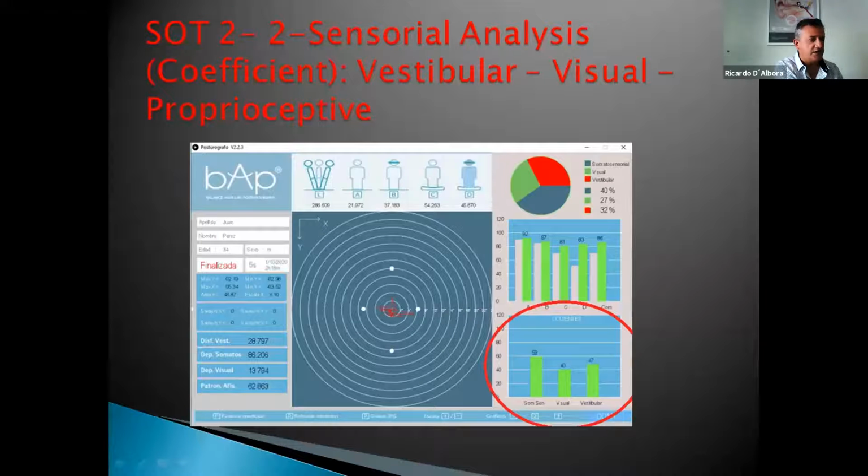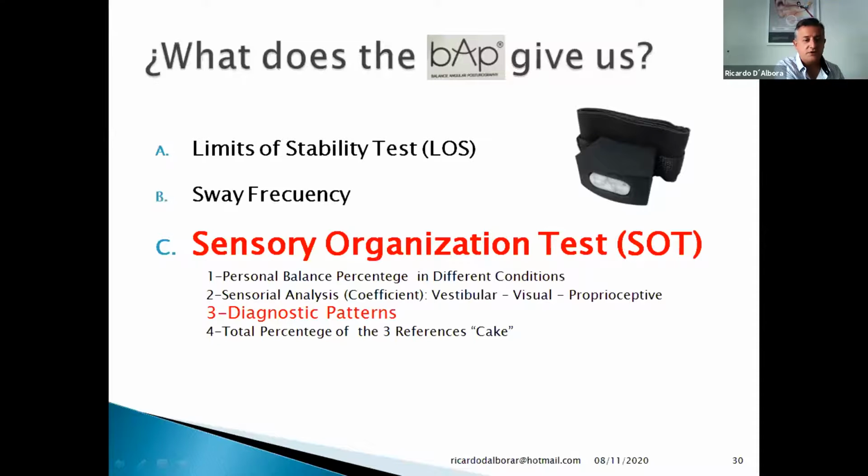In this slide, we can see the different coefficients of the analysis, the sensor analysis in the back screen, here in the circle, the red circle. Diagnostic patterns.